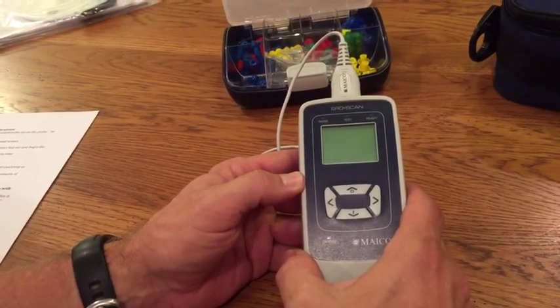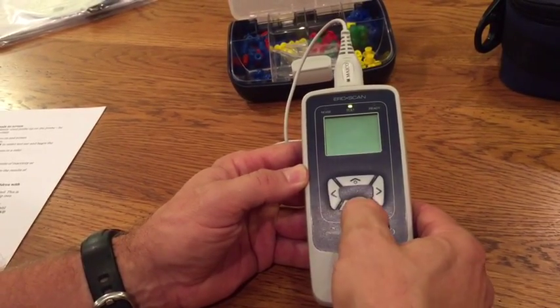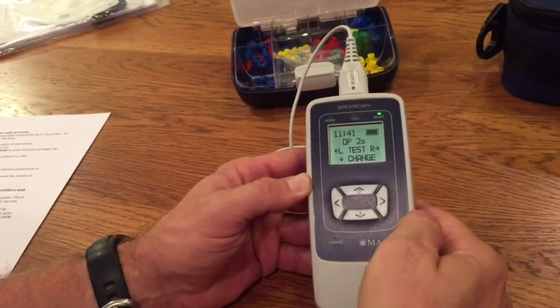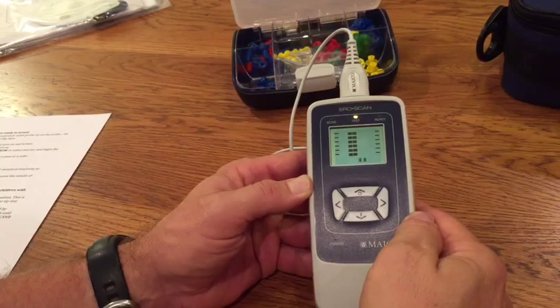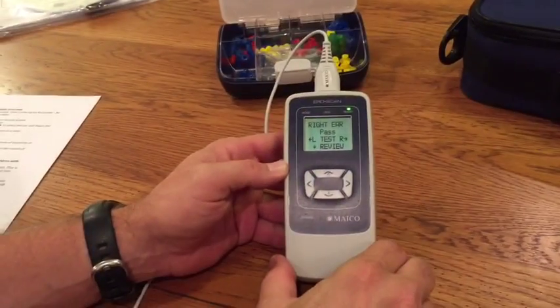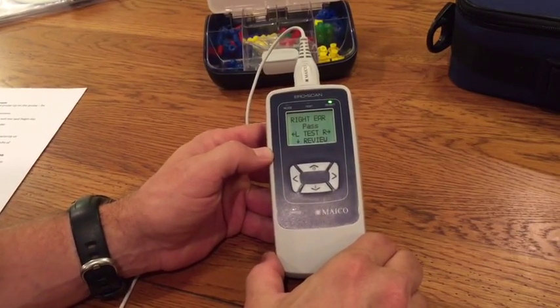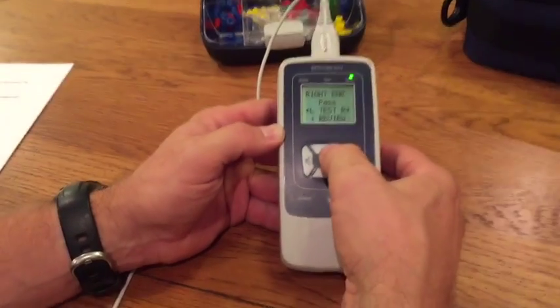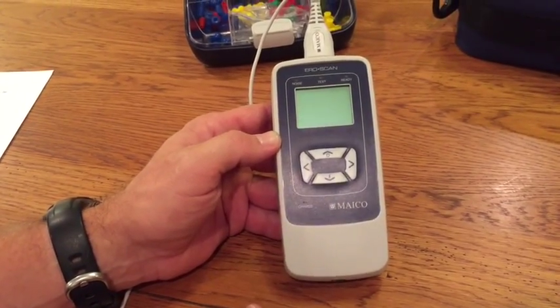Once the probe is placed firmly in the ear, you're ready to begin screening. With this equipment, only two button pushes are needed: use the down arrow to turn the unit on, then either the right or left arrow button to begin screening, depending on the ear. The test begins and you'll get either a pass or a refer result. There is no need to save tests — the machine automatically saves completed test results up to 250 tests, after which the oldest tests fall off as new ones are added. To turn the machine off, either hold the top button down or let it turn off automatically after one minute of inactivity.